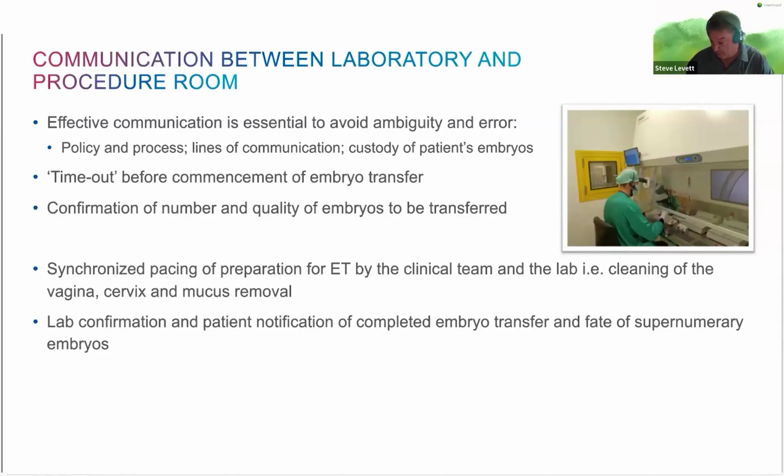If you have the ability in your lab and clinic to show the patients the embryos, which many do now, that's of course of benefit. Ultrasound guided transfers sometimes distract the patient. They can watch a screen rather than be concerned about what's going on. And again, if you use ultrasound, there is an occasion where you might see a little flash, where it's actually an air bubble mostly that you see, but still the patients can be reassured that the embryos followed that and are going to be in the right place.